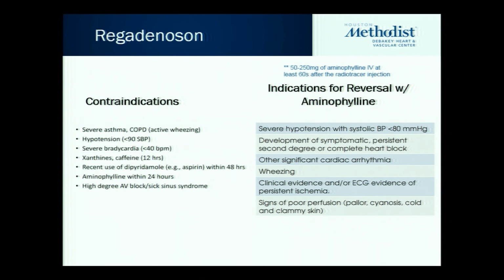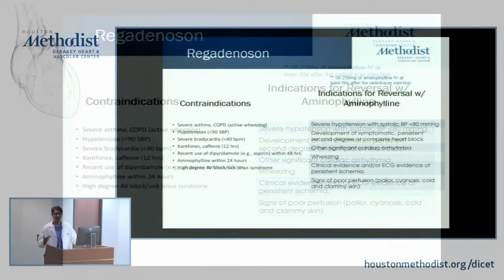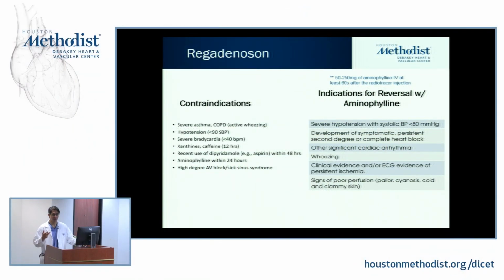Now, one of the things that you've commonly seen is patients being reversed with aminophylline. How do you do this? You can give anywhere between 50 to 250 milligrams of aminophylline, and it can be done as early as 1 minute after the radiotracer injection.